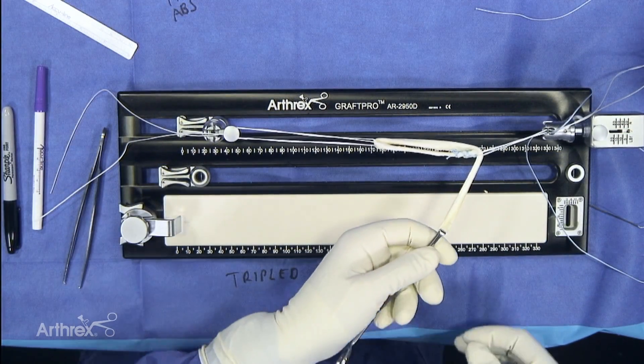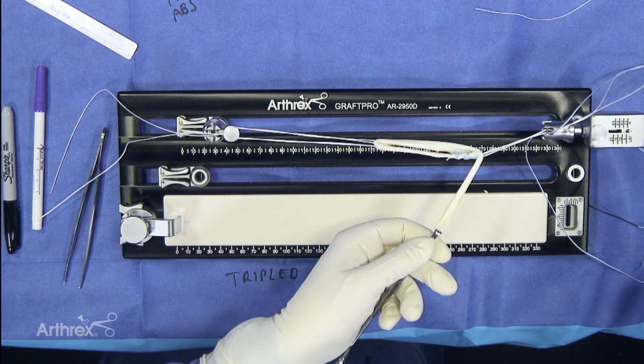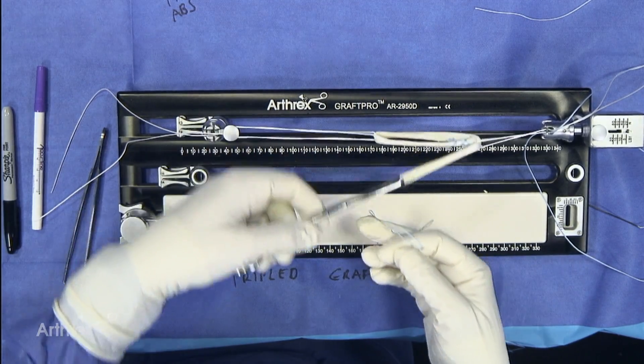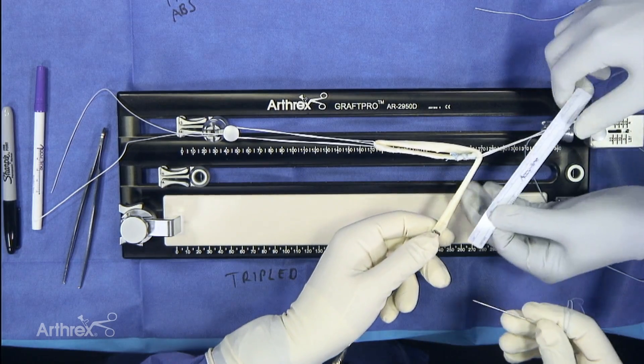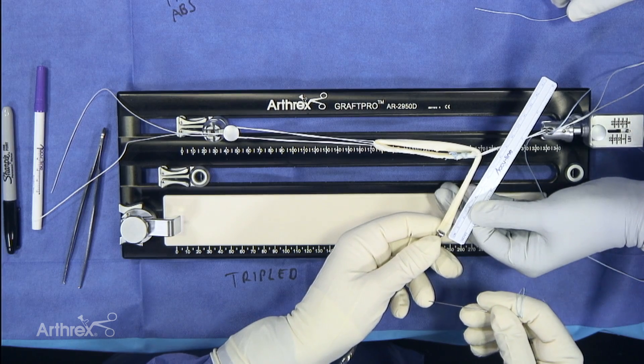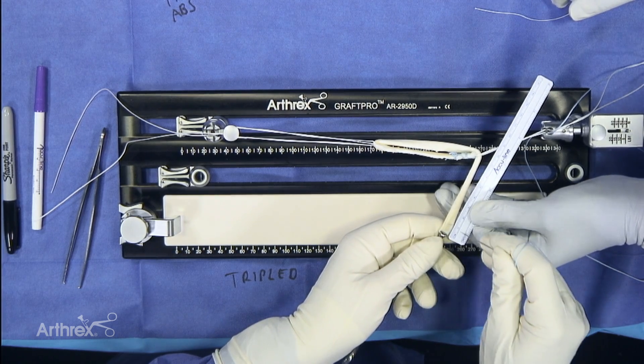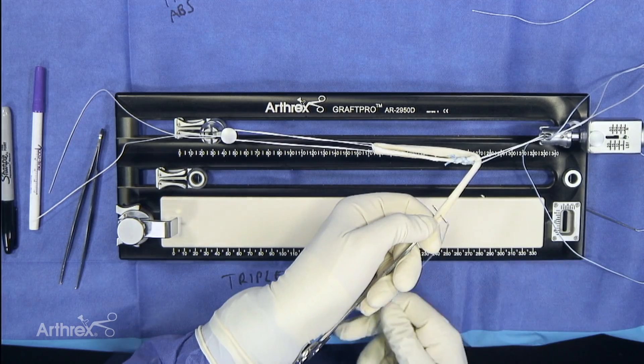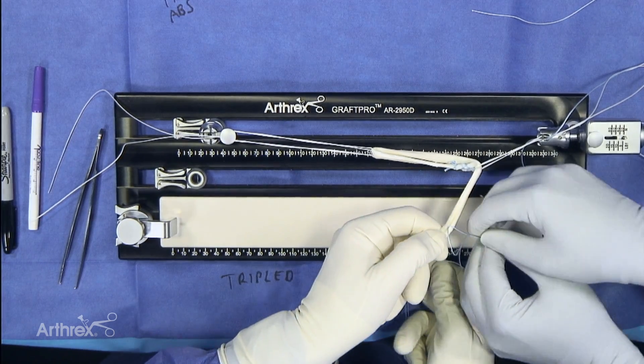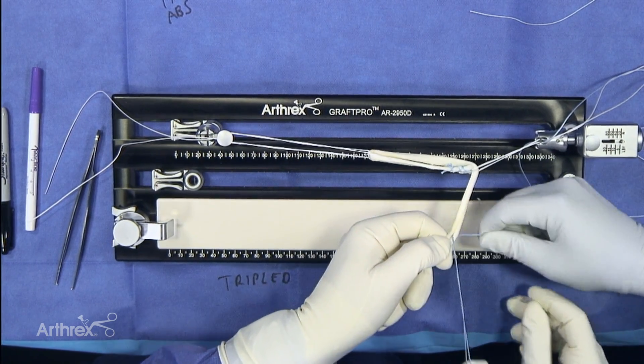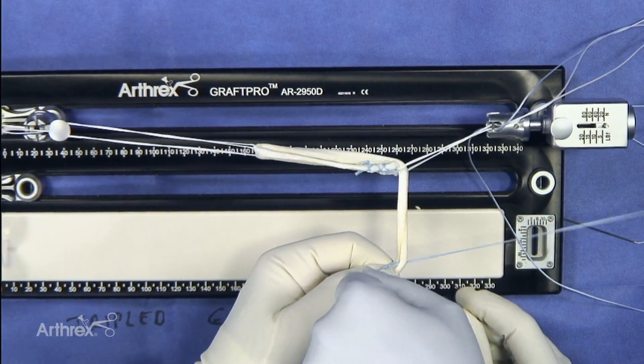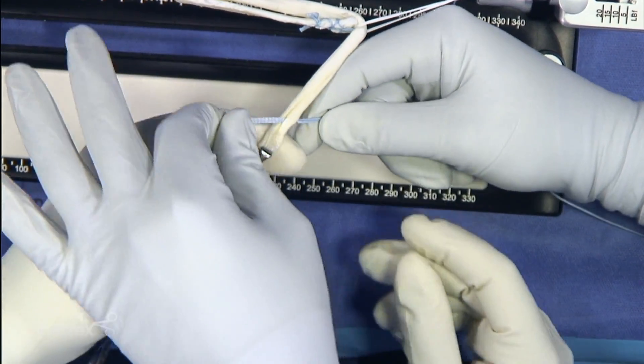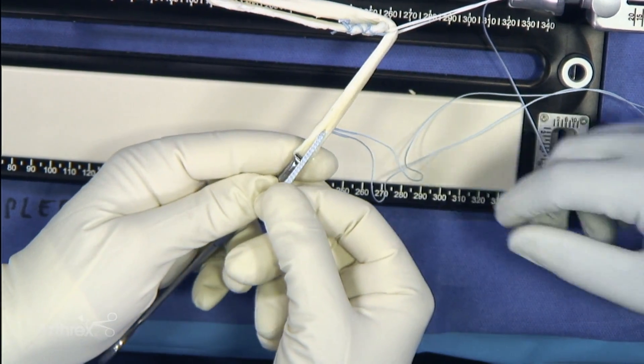So now we're going to take our fiber tag again and we're going to end up with our standard two tails coming out so that we can use those as backup with a swivel lock. We'll go up about 15 millimeters or so, we don't have too much suture in the joint. So we'll poke through. And this one, as opposed to the last one where we left a little tail, this one we're going to pop down and leave this entire tail just about so that it sits flush with just a little overhang like this.